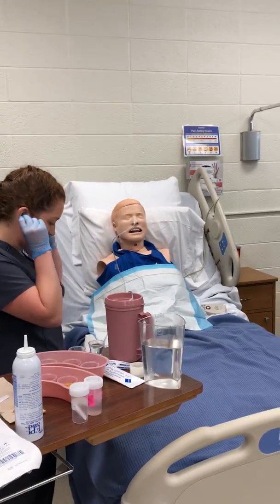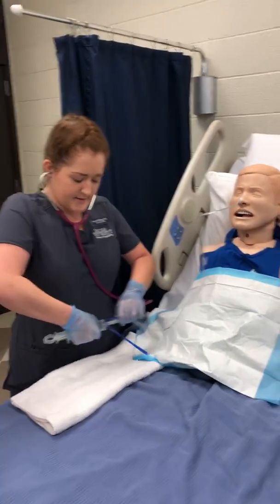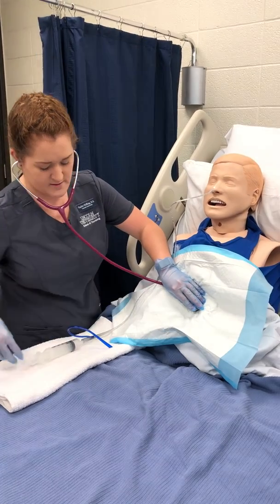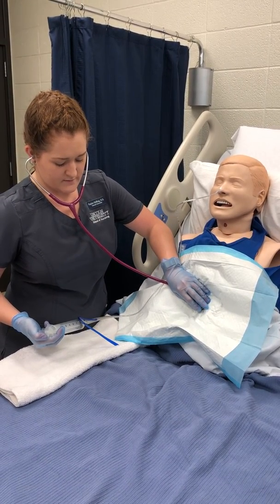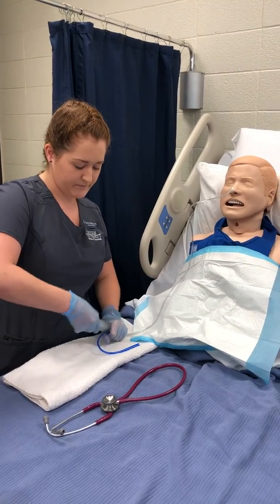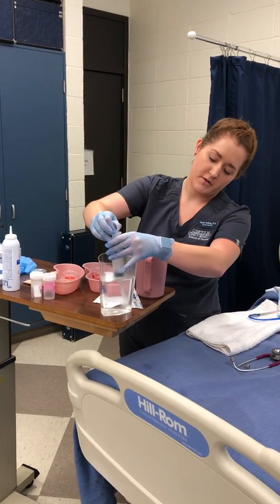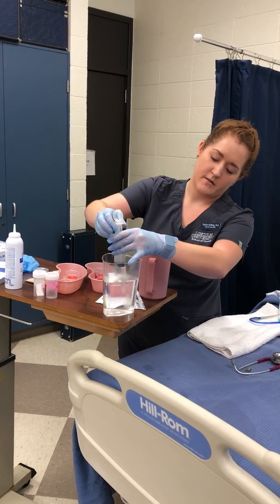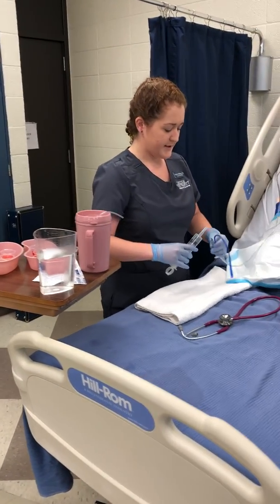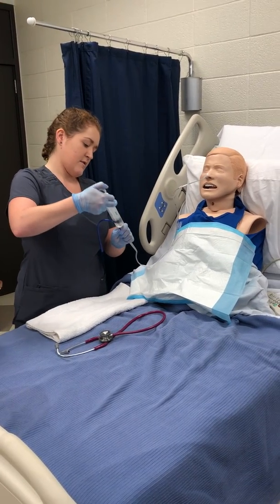So we're going to check placement again. This time I'm just going to do another air bolus, about 20 mLs. I do hear that whooshing sound again, so the NG tube is still properly placed. Before administering the medication, I'm going to go ahead and flush the tube — about 10 to 20 mLs of sterile water, which I've prepared ahead of time, just to help the process go easier. I'm going to remove the cap preventing air from coming in, and I'm going to flush.